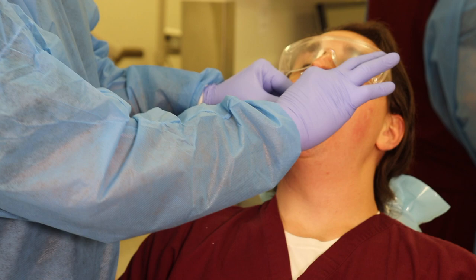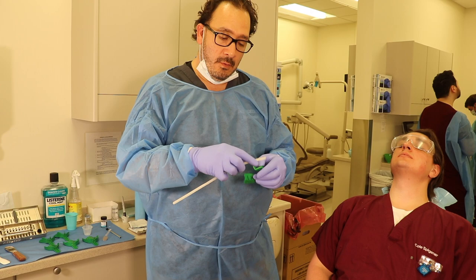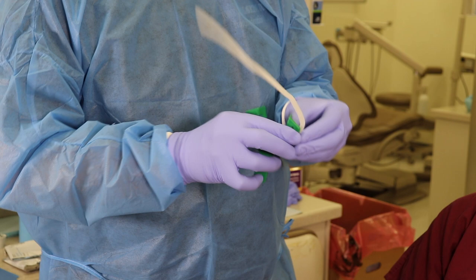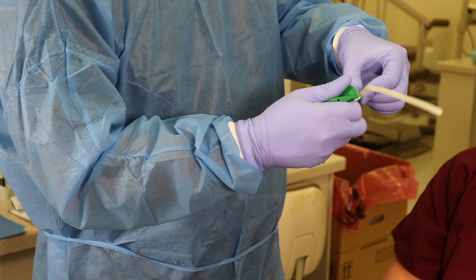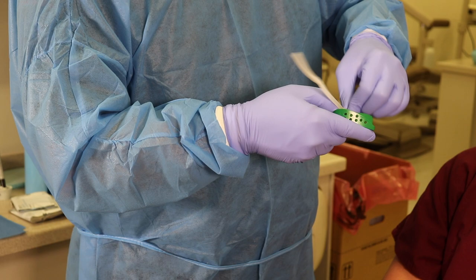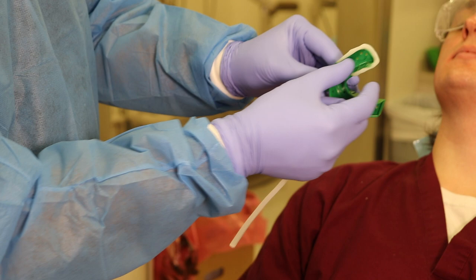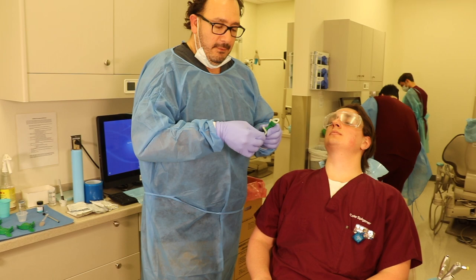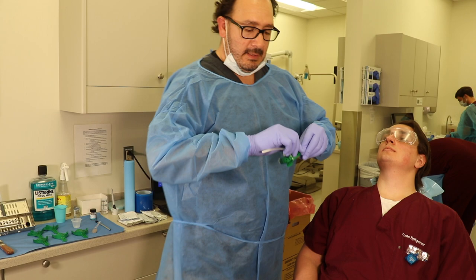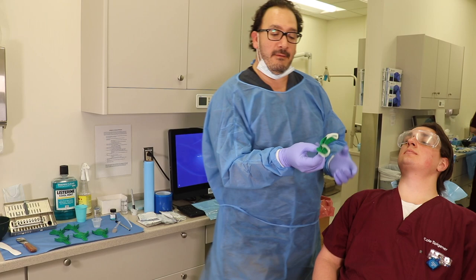If for any reason the tray does not cover all the teeth, we can always add wax around the edges of the tray just to make it a little bit bigger. The wax on the tray will also help it fit better in some portions. It'll get a little bit bigger and can copy the deepest part of the vestibule better. You don't have to use it all the time, but if you see that you have the correct tray size and you have, let's say, third molars, maybe you want to add a little bit of wax like that. This wax is very soft and very moldable.